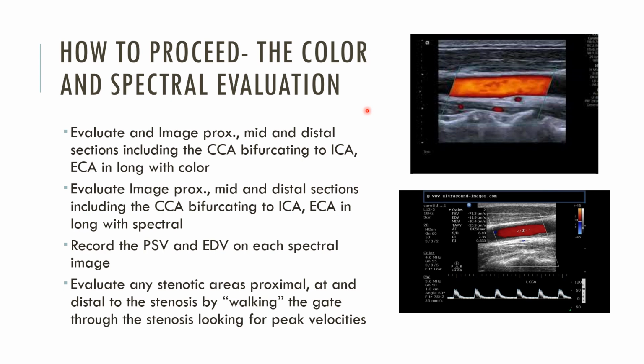Next, you're going to go ahead and add some color. With our color, we want to utilize good, standard color practices. So you see in this image here, we have our Doppler angle, and it is shifted or directed towards the patient's head. This is going to ensure that we're not hitting that carotid vessel with 90 degrees. If our color beam is hitting that vessel at 90 degrees, we will not get adequate fill. So they're having good practices there by steering their box one direction or the other.